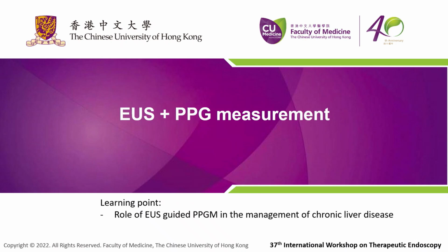So Professor Chang will be demonstrating to us EUS plus PPG measurement, commentated by Professor Shannon Chen and Professor T.T. Chen.